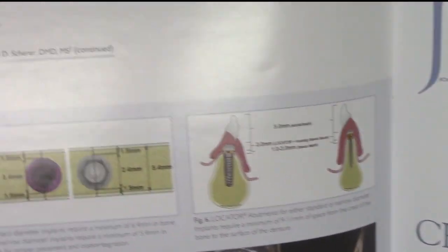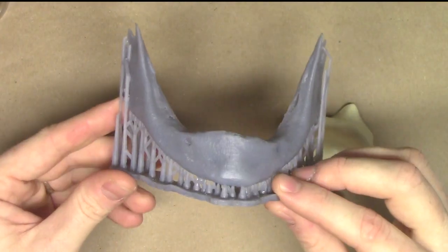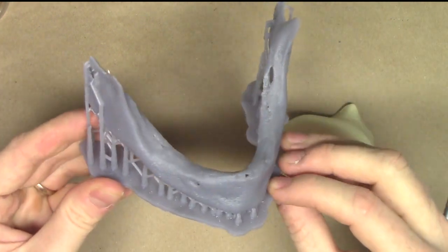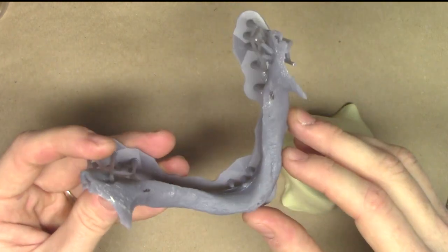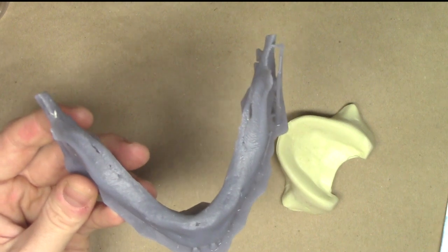So now when we start thinking about some of these bone volumes, we can of course see that if I showed you this example of a patient, this is somebody's mandible that we used as part of a training course at UNLV School of Dental Medicine in conjunction with Dr. Andrew Engel. You can see here, this is a patient that we successfully treated with Zest LODI implants.